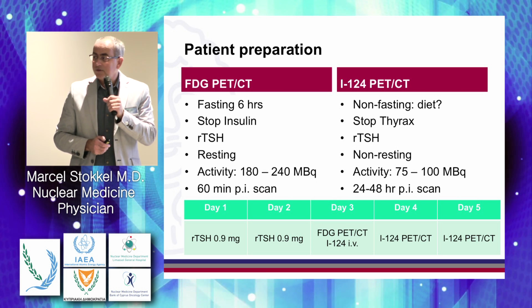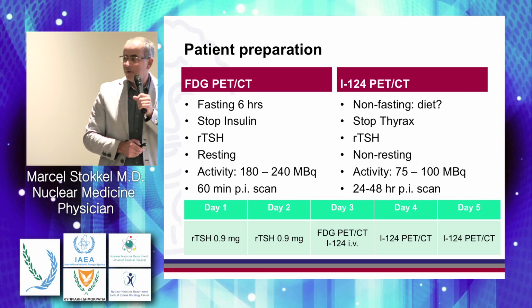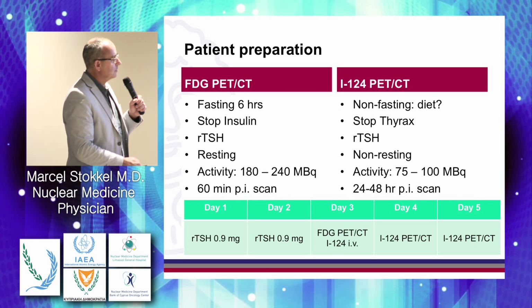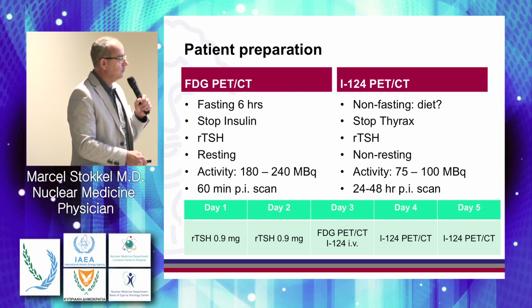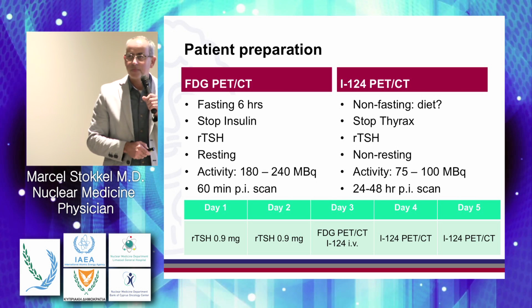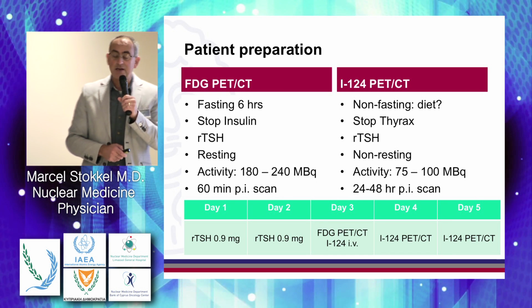Why is that so important? Well, you can combine the two tracers in a very practical mode. What you can do is start on Monday and end on Friday and do the whole procedure in one week. It is not a one-stop shop procedure because the patient has to come back each and every day.